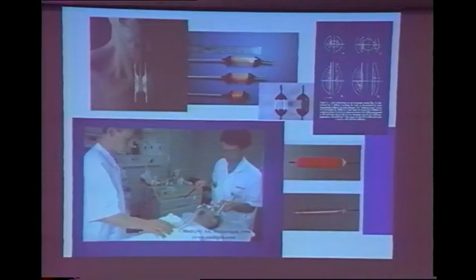The group in Switzerland did esophageal treatment with a different technique in which they made a rigid device that goes into the esophagus with the diffusor already built into it.